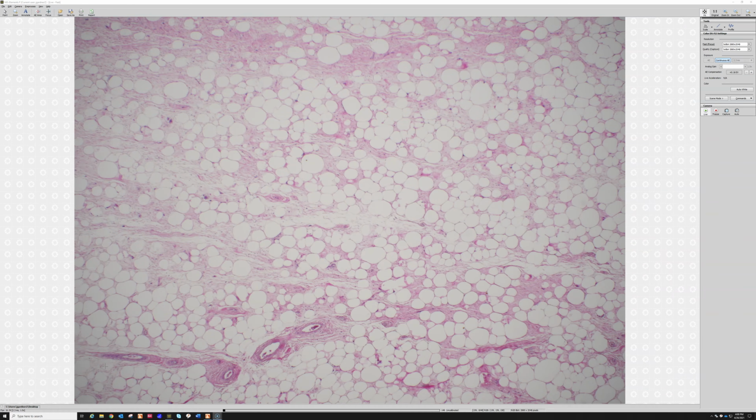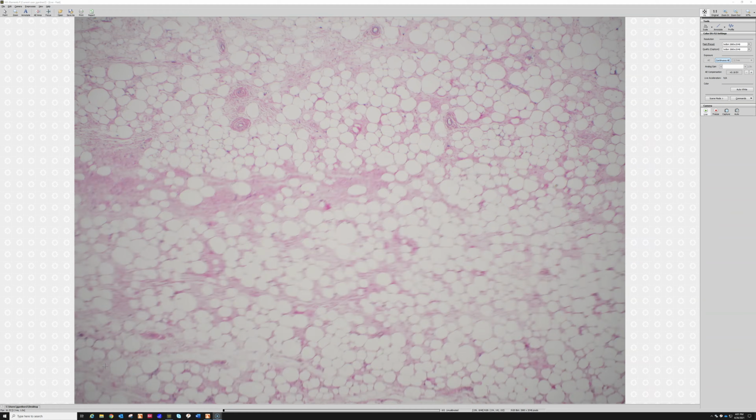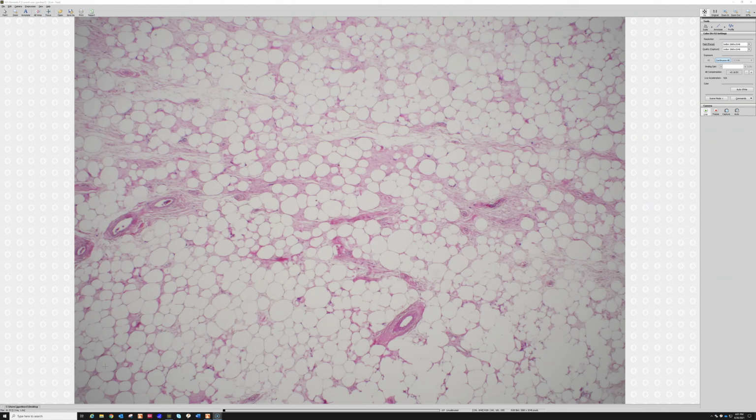So if I see a tumor that looks like a lipoma, but is really large, like bigger than 10 centimeters, I tend to usually like to do MDM2 FISH. The characteristic molecular finding in well-diff liposarcoma, atypical lipomatous tumor, is amplification of the MDM2 gene, as well as other genes that live in that same region on the long arm of chromosome 12. So that's MDM2, CDK4, and a handful of others. But the most common one that I usually test for is MDM2 because that's the FISH that I have available.